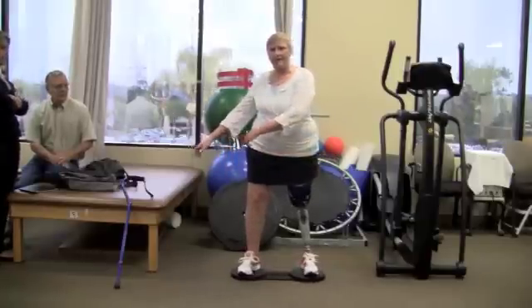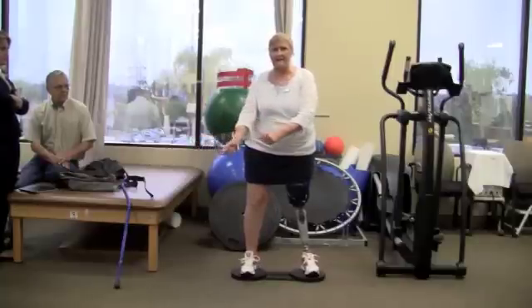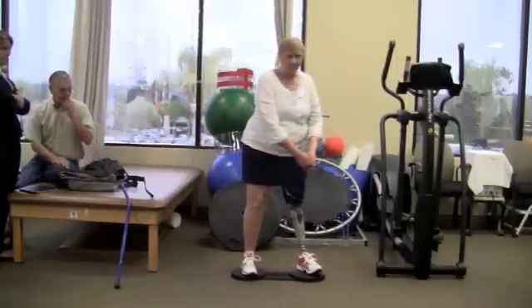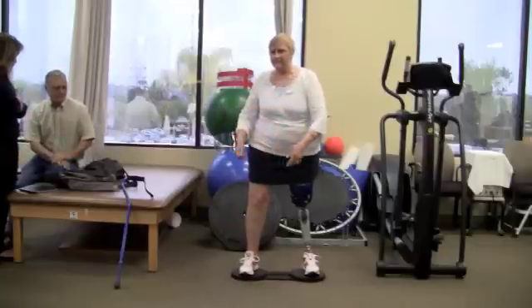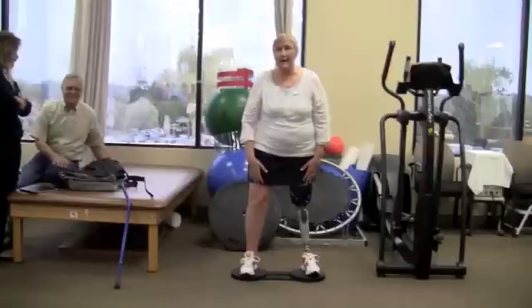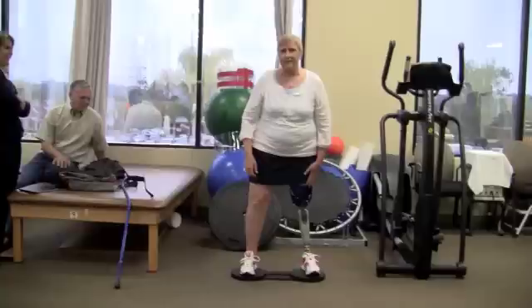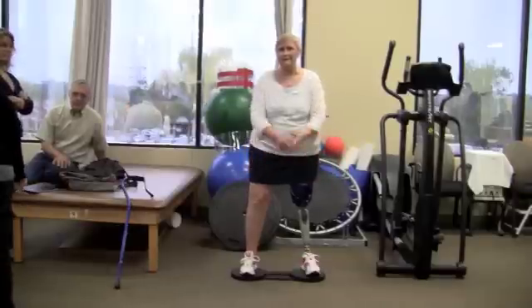The 8-board is geared to getting motion from the hips. This transverse plane is really what the 8-board addresses, and it's very important in physical therapy whereby BOSU balls and balance boards of other types work on multiple planes and are frankly too difficult for many patients.